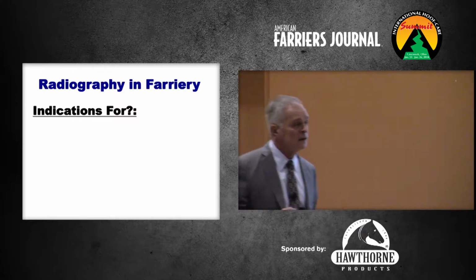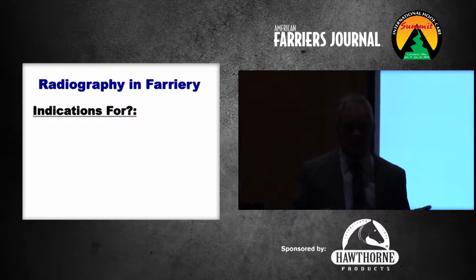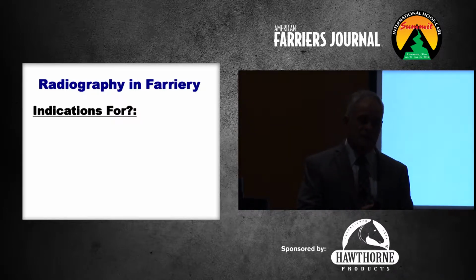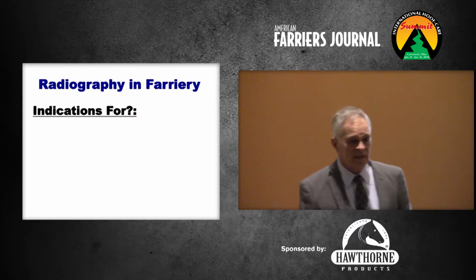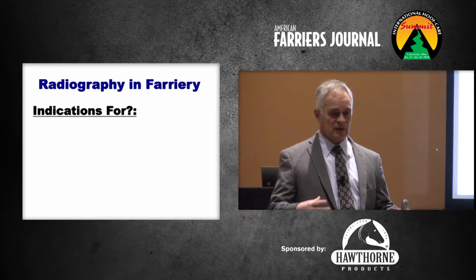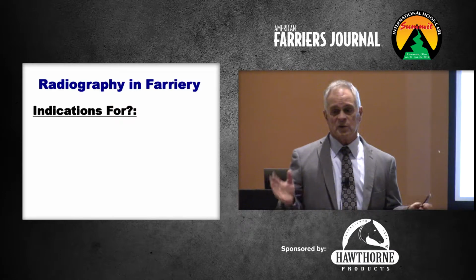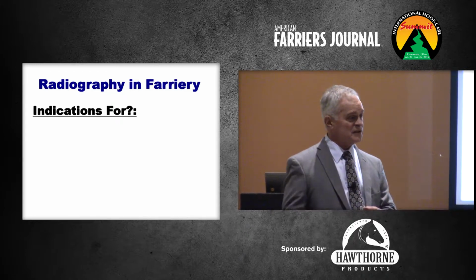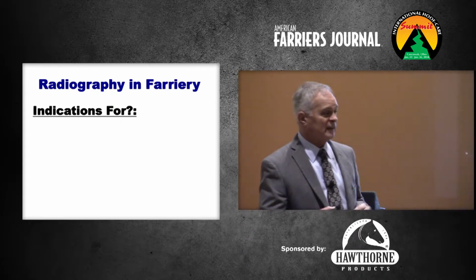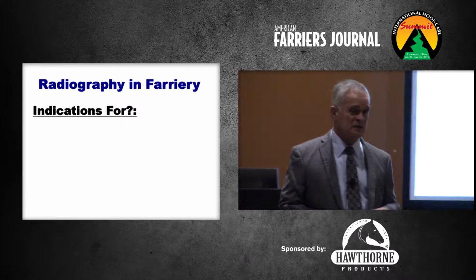Okay, any other? Okay, baseline, that's a good idea to have baselines. It's been discussed as part of wellness exams in horses, and Dr. Myers was mentioning it with his own personal horses, if you had a bank of when that horse was young and normal, what its feet were like, to come back and compare to, because whenever a horse gets in trouble, it is really nice to have something to go back to and say, okay, I see how it's changed. You'll see some practices actually put certain views of the feet in their wellness program, and then just bank them, just like blood work.